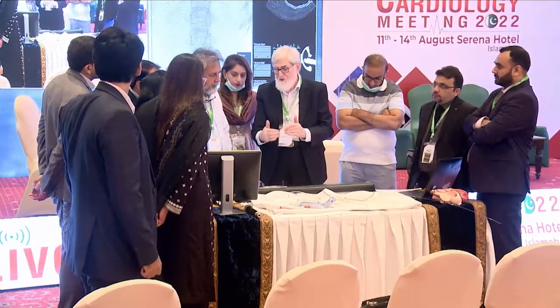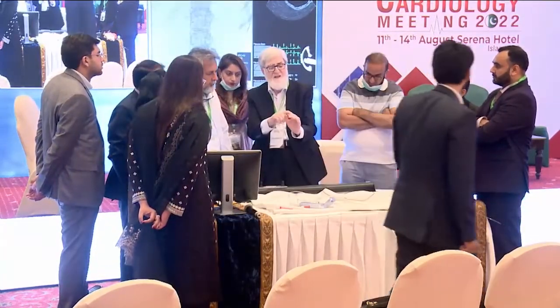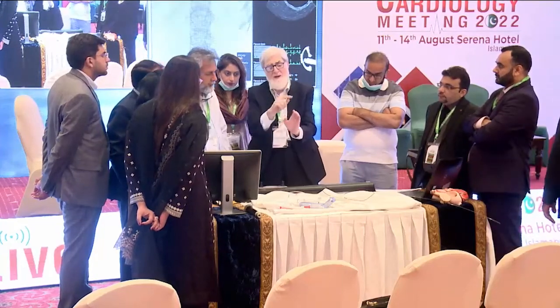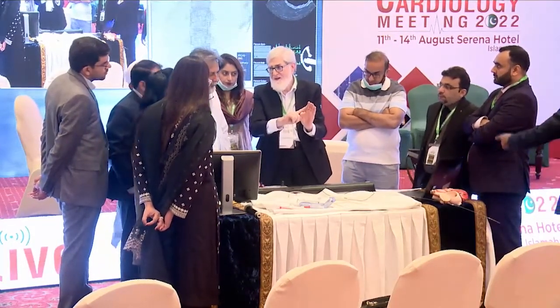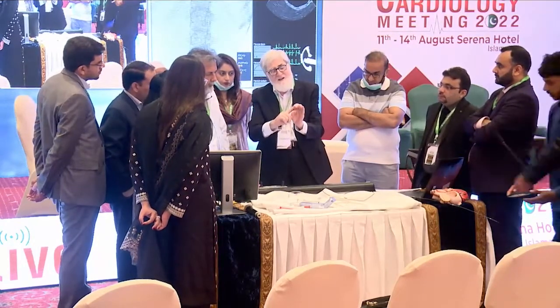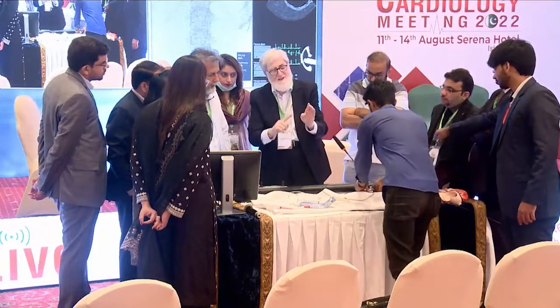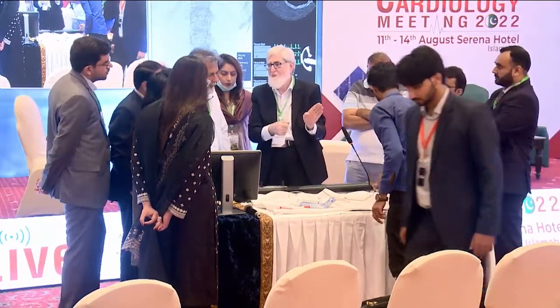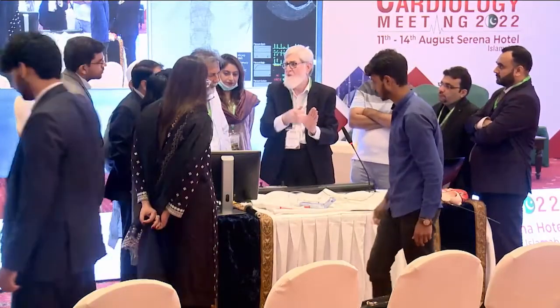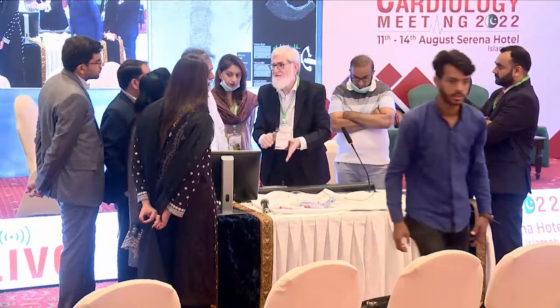So sometimes what happens is that this is the iliac vein going like this. We put the dilator like here. So the dilator comes at the tip of this, and the wire doesn't go. The trick is that you just slightly pull back and the wire will move up. You understand this? Yes. So this is practical life.